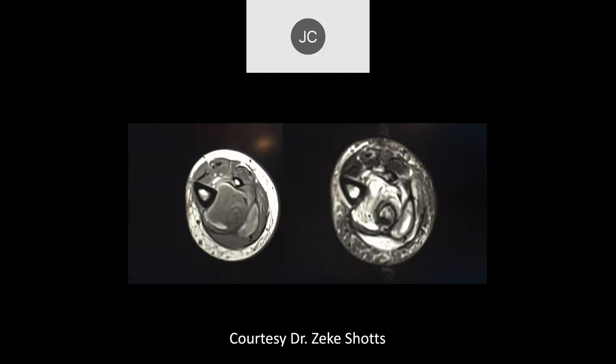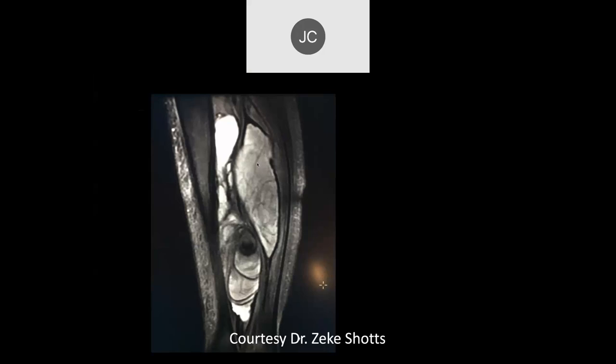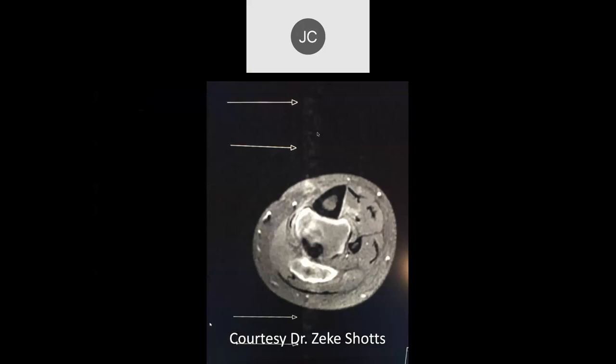Last time it's like a pseudoaneurysm, something like that, right? Yeah, but what we see here is a very funny appearance for an abscess, but certainly could be. But we have this kind of swirling pattern within this. But then here we notice that there are just large amounts of pulsation flow artifacts. So now you have to be concerned about aneurysm.